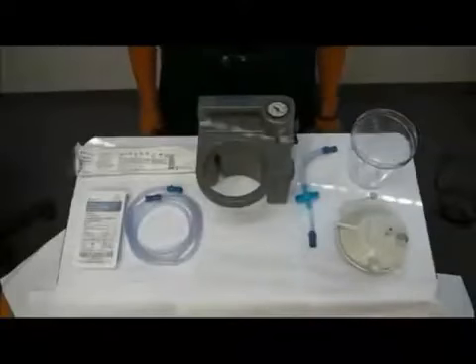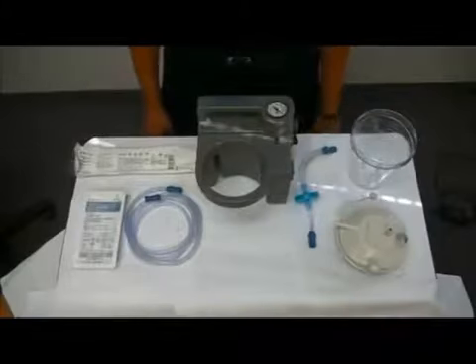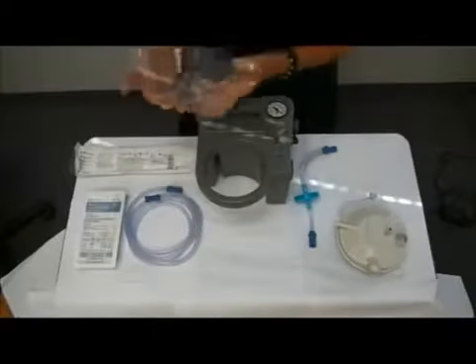I'm going to show you how to set up and use a suction machine for either tracheal or oral suction. First of all, I'm going to show you the canister — this is the collection canister.